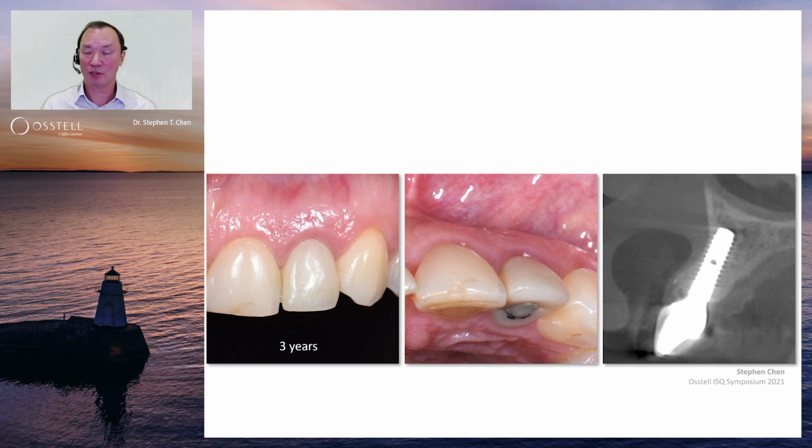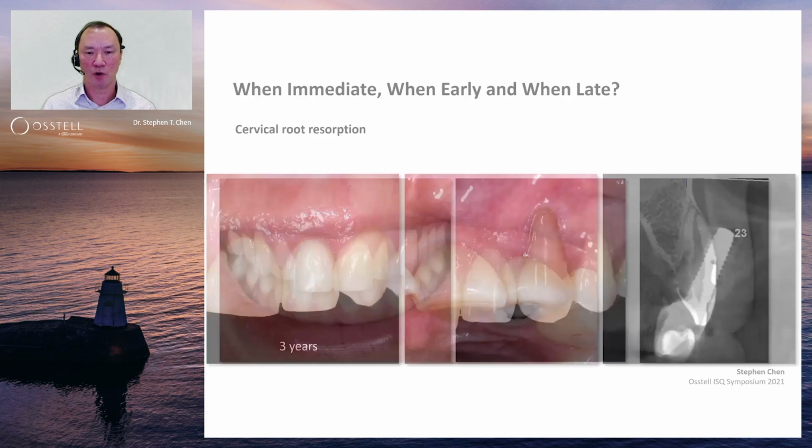It's now, as I mentioned, in the new biomaterial. The biomaterial is the new facial bone wall, and the soft tissue then is supported by the newly reconstructed facial bone. So again, no reason to expect that an implant like this would not remain stable, both functionally and aesthetically, with stable soft tissues over a period of time.